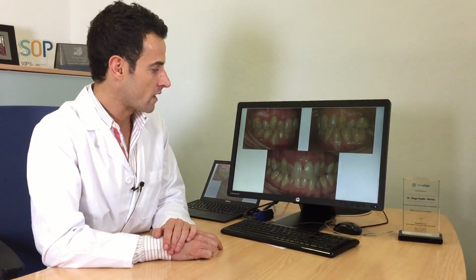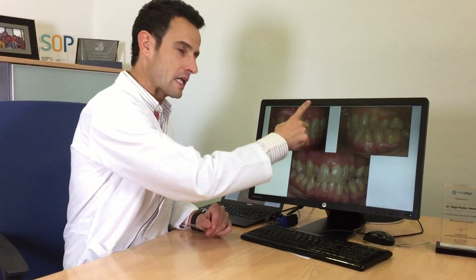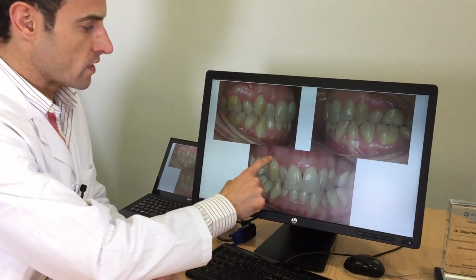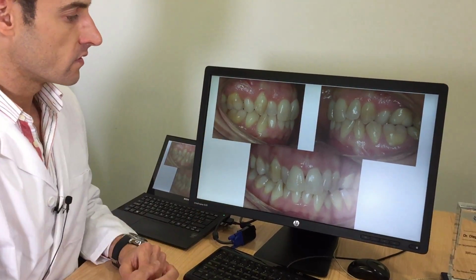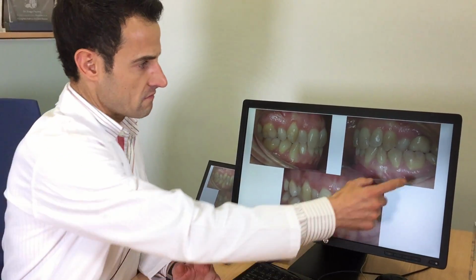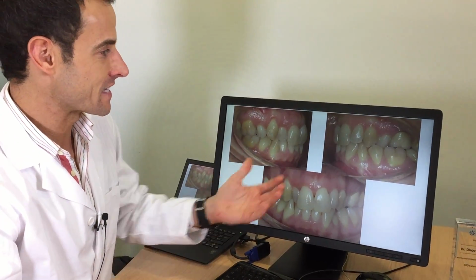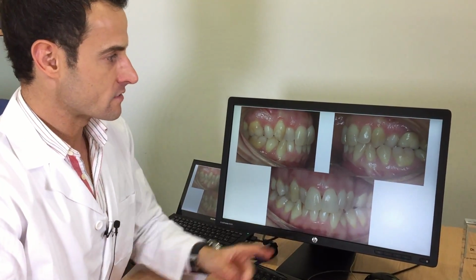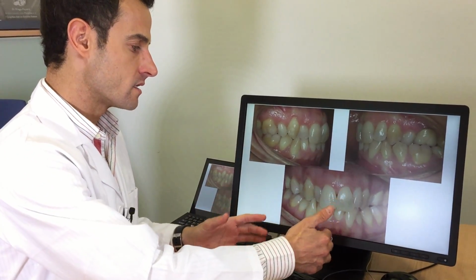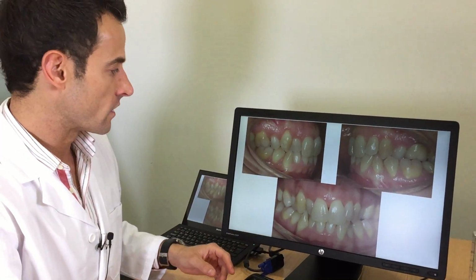She came to our office with this terrible situation, with periodontal problems. You can see these big rotations with this big loss of gingiva all over the mouth, with this lack of proportion, these old crowns. For me, it doesn't make sense to have these old treatments. You can see also here the negative torque in canines and premolars in the lower arc also, and the crossbite here.